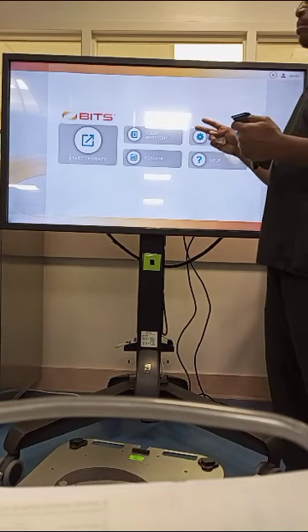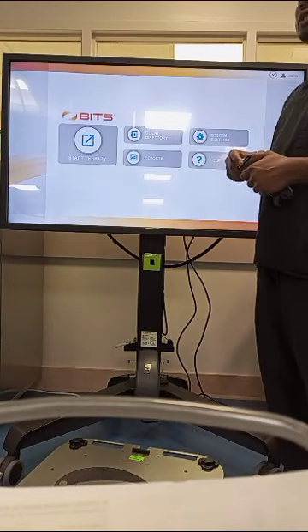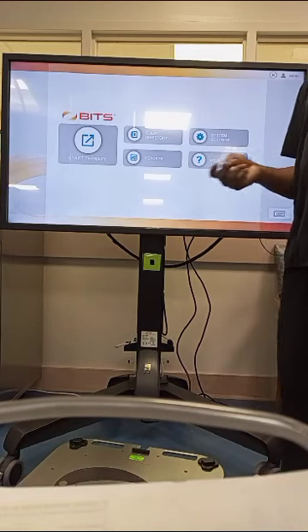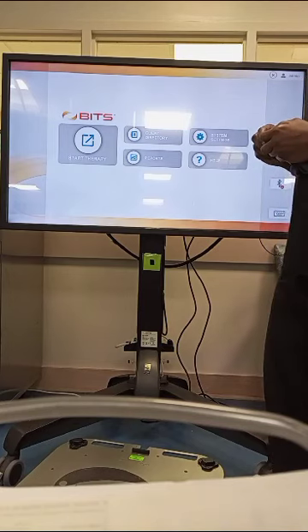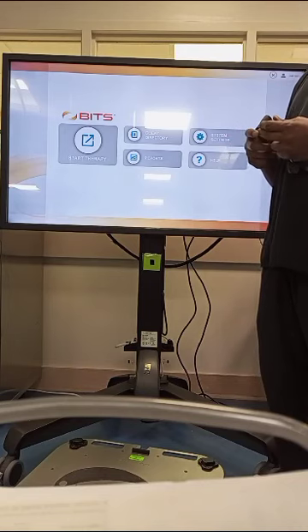challenge the visual, cognitive, as well as the balance deficits that most neurological patients experience. Not just neurological patients, we have myriads of cases that may require the therapist to challenge or to work on the balance or visual or cognitive problems that these patients may come down with.